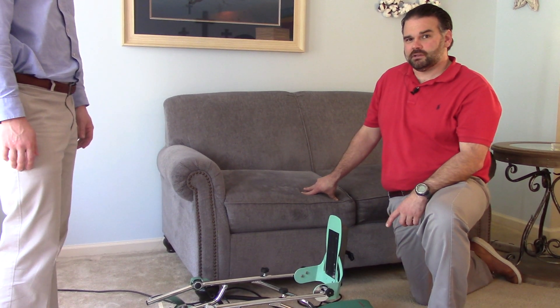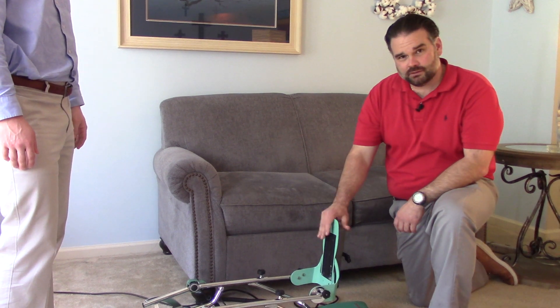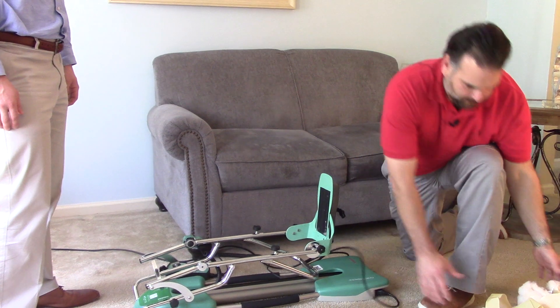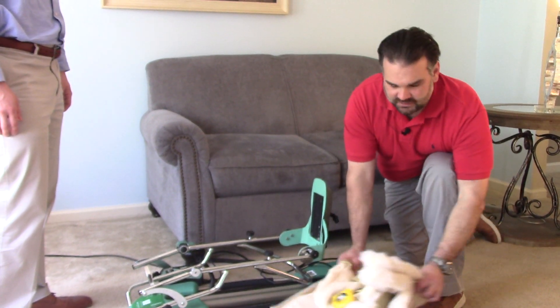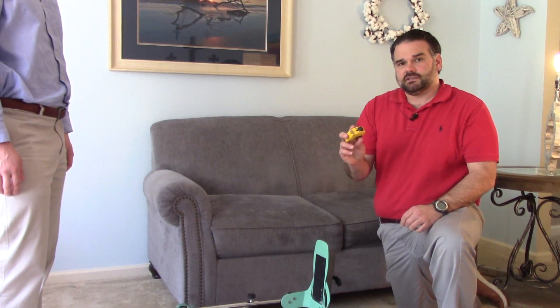Hey, my name is Mickey. I'm here to help you with setting up your CPM. When you receive it, you're going to have the CPM itself, a power cord, the pad kit, which we have over here to the side, and you're going to need a tape measure.